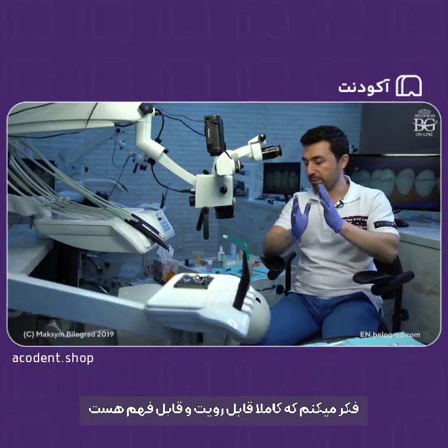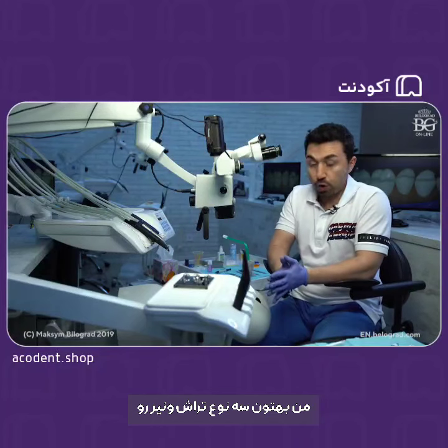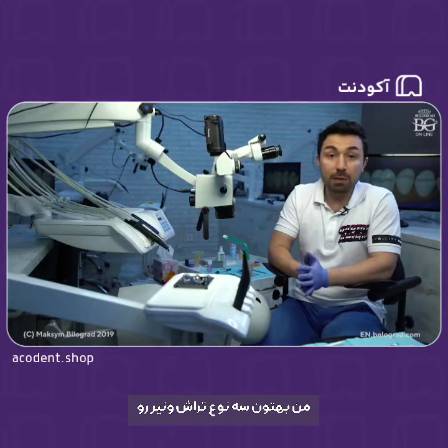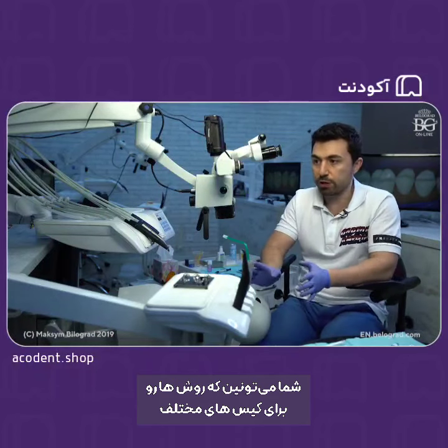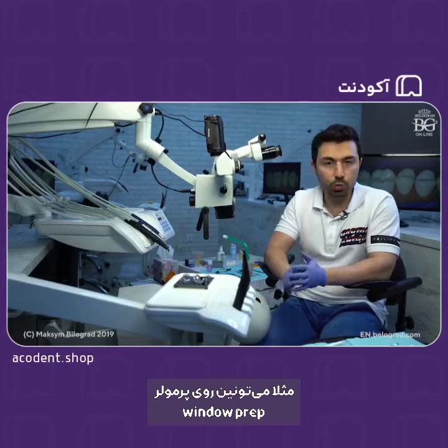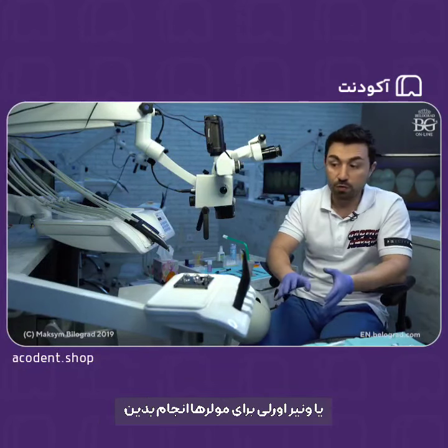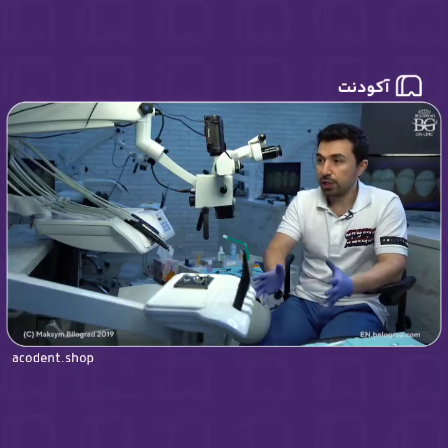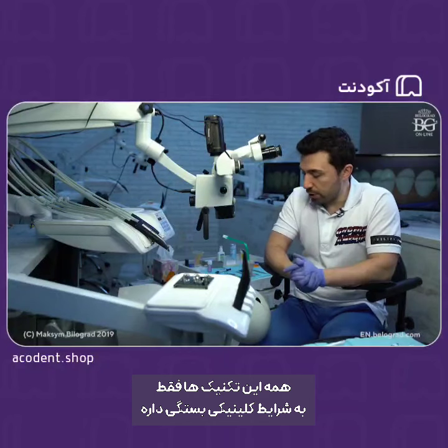I hope so. So, during this online masterclass, I showed you 3 different types of veneer preparations for molar and premolar. You can combine these different types of preparation for many clinical cases. You can do window prep on premolar, you can do occlusal reduction and veneer overlay on molar teeth. It's just about the certain clinical situation, okay?